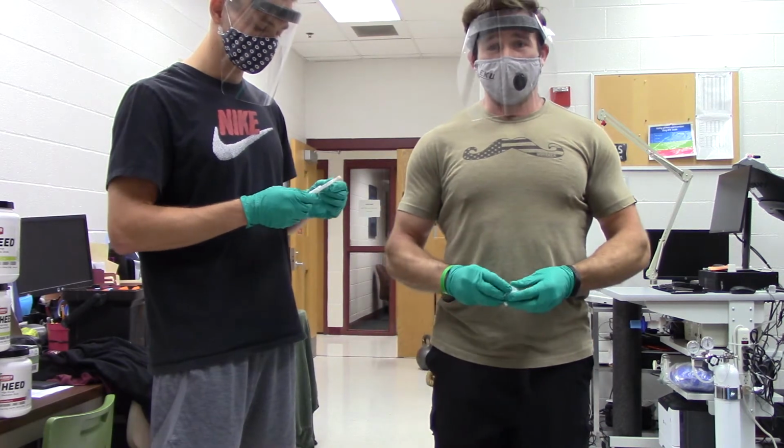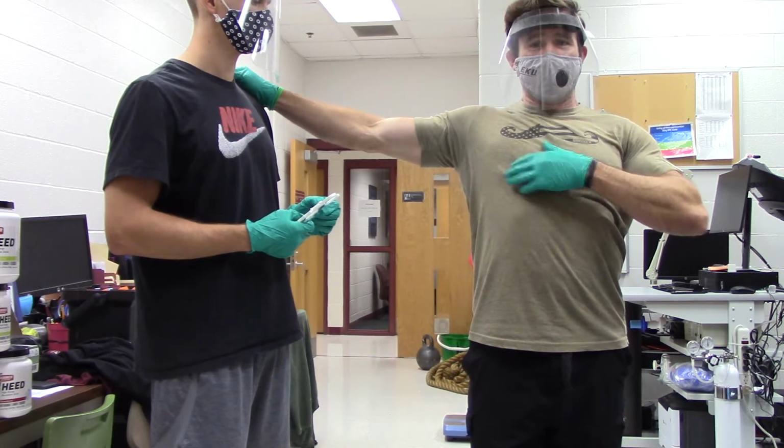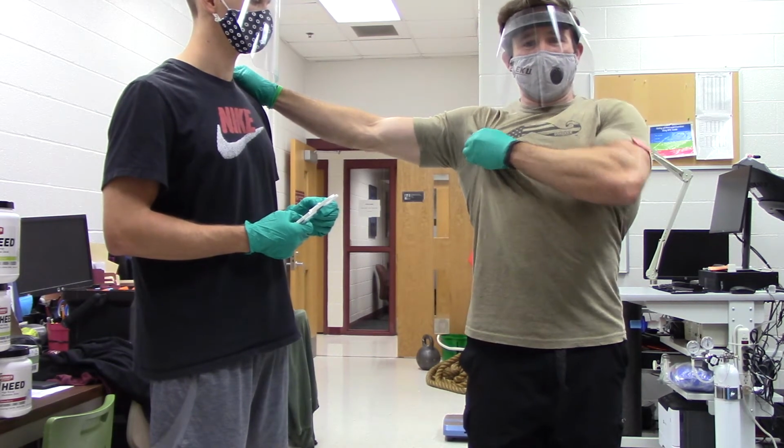So the easier way to make this work in that situation is you're going to have your arm resting on your partner's shoulder, so you widen this structure out, and then you're going to be able to get into that 1/3 a lot more easily.